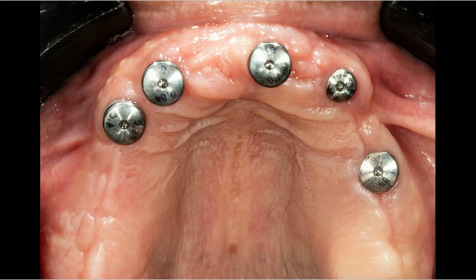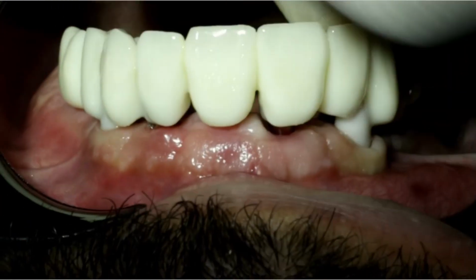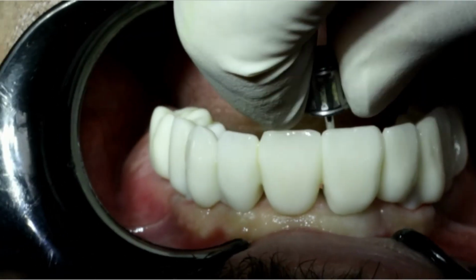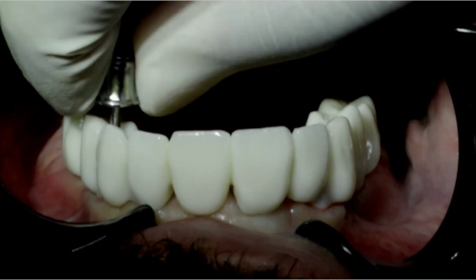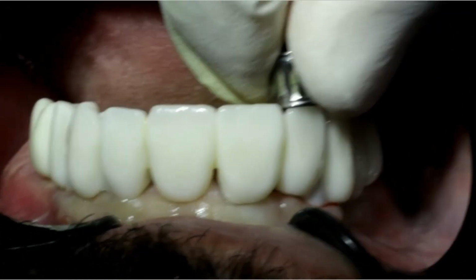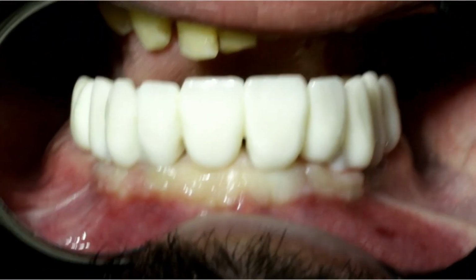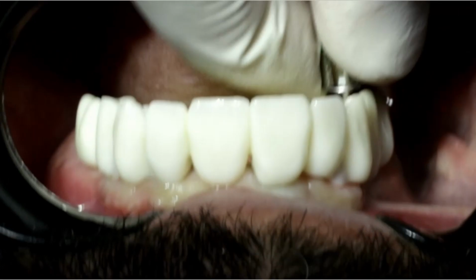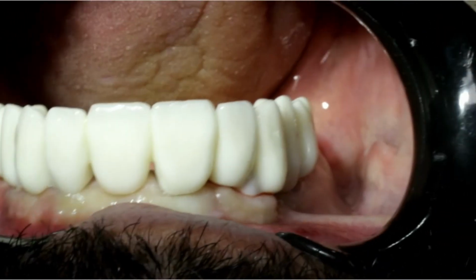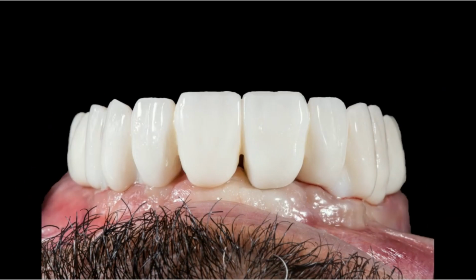Look at the delivery of our full arch monolithic restoration in a very easy manner. Of course, this delivery needs accurate scanning and accurate capturing. So, delivery of monolithic zirconia screw-retained pieces in just 5 minutes. Look at the ease of delivery of the full arch prosthesis. A very smooth workflow: just tightening the screw and occluding the screw access channel with Teflon and then composite. It's the final result, adapting well.